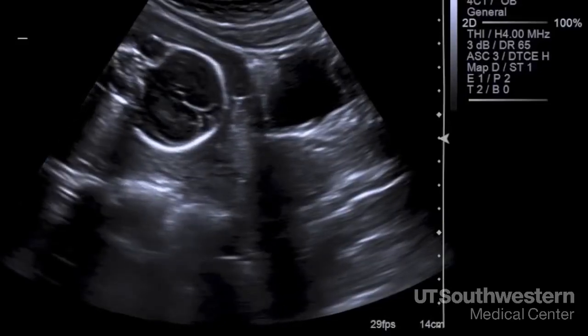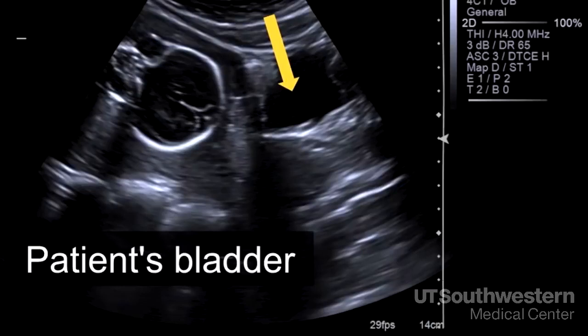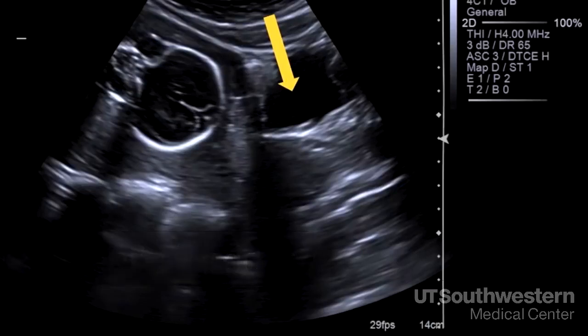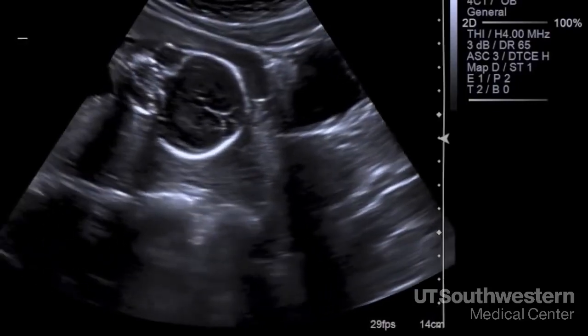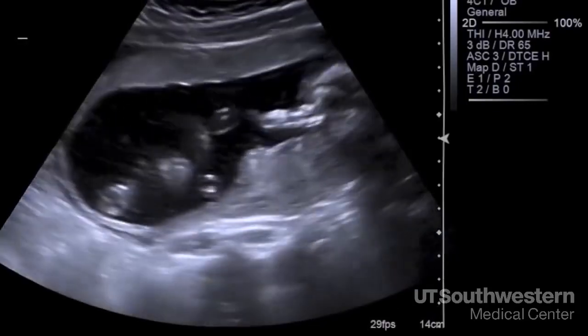On ultrasound, fluid is black, bone will be white, and other tissues are shades of gray. This is the patient's bladder, and the fetal head is down near the cervix. The position of the fetus doesn't matter at all at this point in time. We often see the fetus completely flip around during the course of the ultrasound.